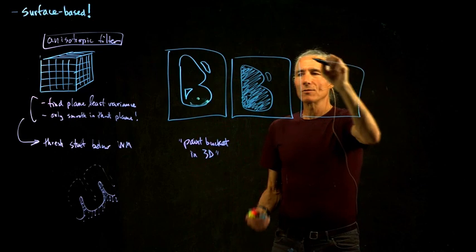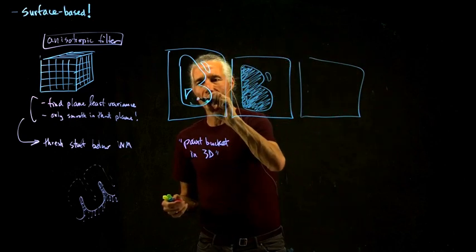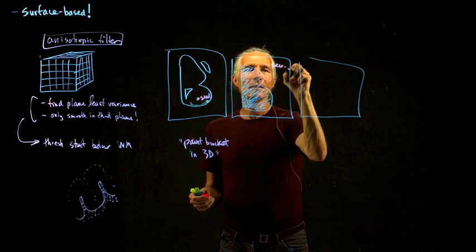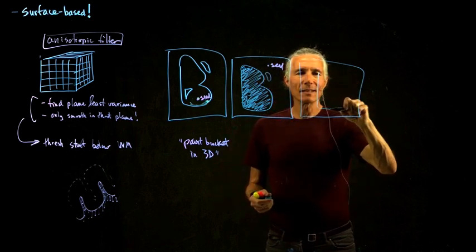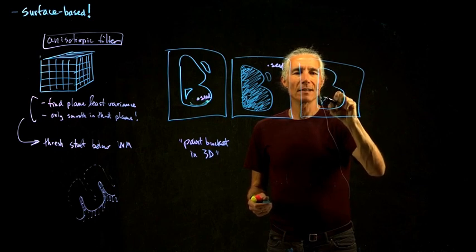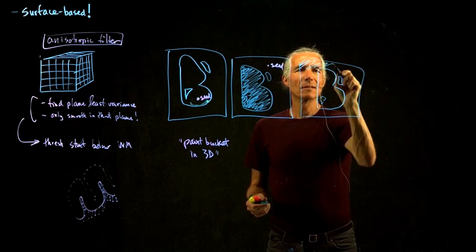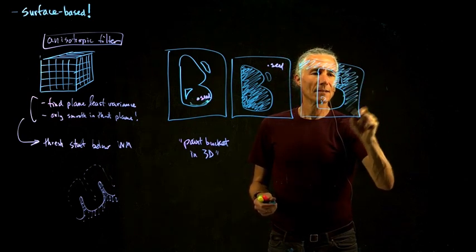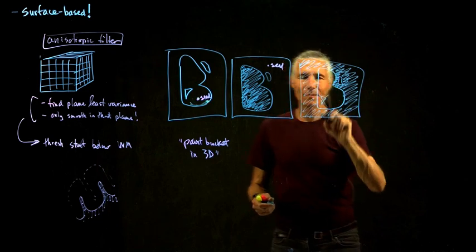So then what we could do is, this is our seed. Start a seed out here. So what's that going to do? That will now fill up the outer part. And that will get rid of this guy. But unfortunately, it will create another void. So now we fill this guy up here. Now we've got some stuff outside of the brain. So we got rid of that guy, but now we created one outside.